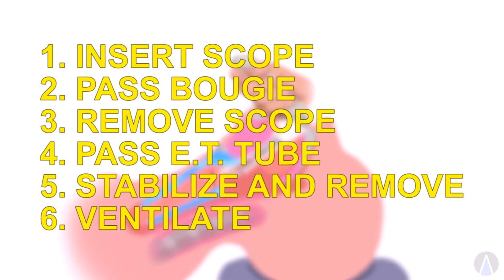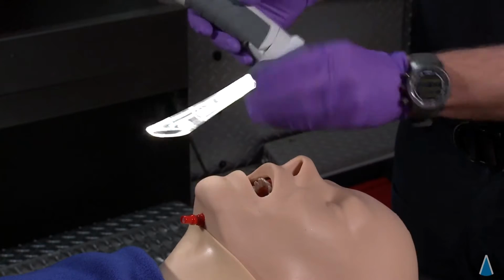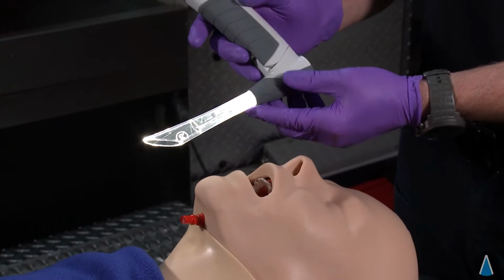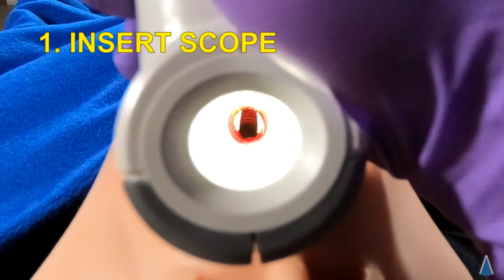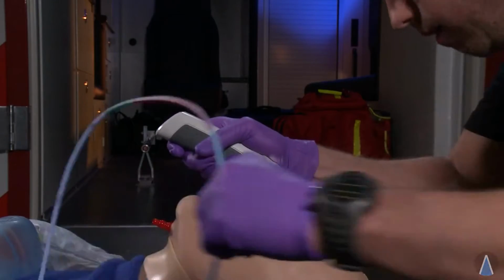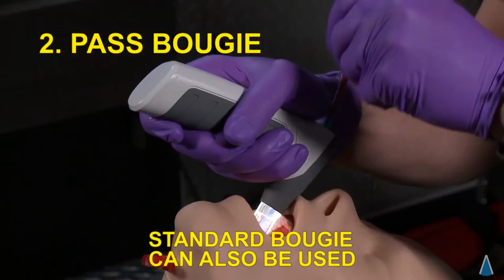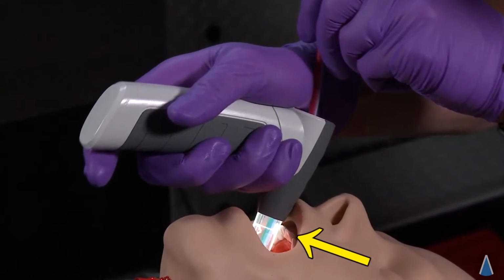Using the V-scope, intubations can be accomplished in 6 simple steps. When you open the V-scope, the LED lights will illuminate once the handle is fully extended. Insert the scope and identify the glottis opening between the vocal cords. Using the bougie, pass the bougie under direct vision between the vocal cords into the trachea until the green safety band has just passed the upper teeth or gum.